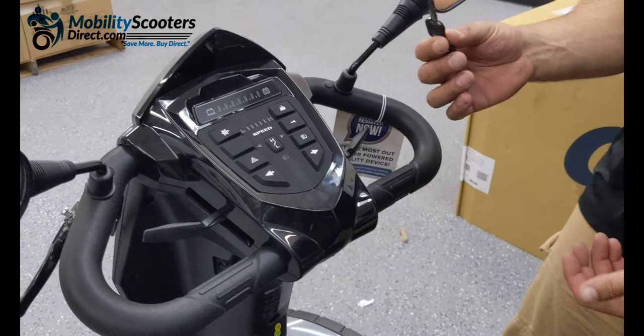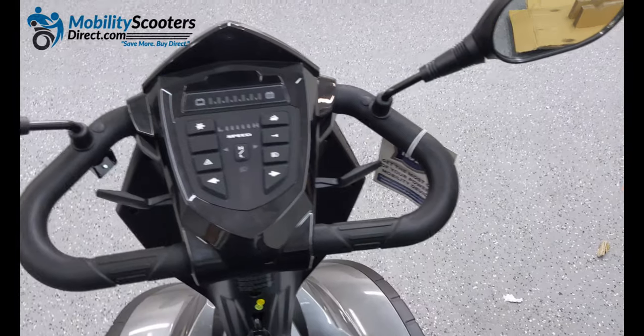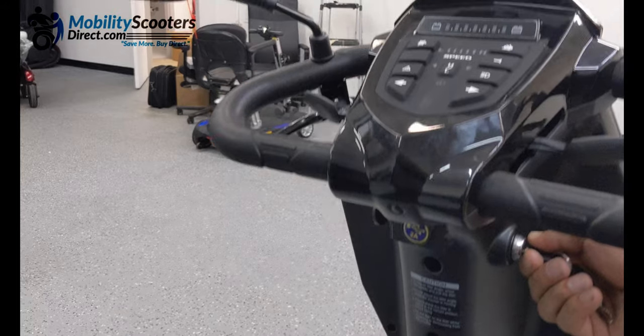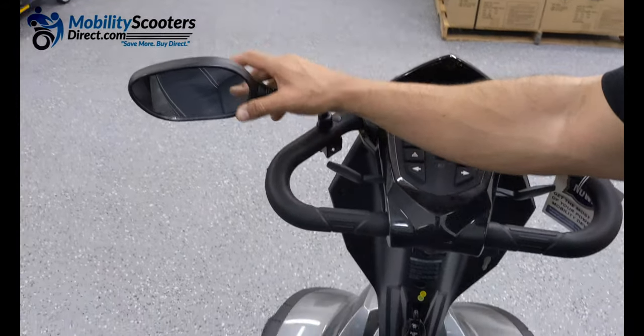The keys come attached to the right side of the tiller handlebar — simply cut them off. It comes with a spare. The ignition is on the right side. Turn the key a semi-turn clockwise to turn on the unit and you'll see the lights turn on.